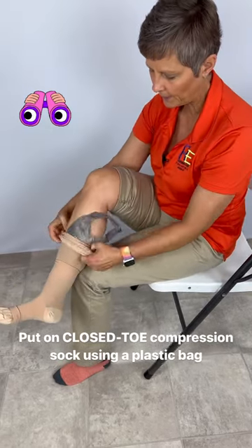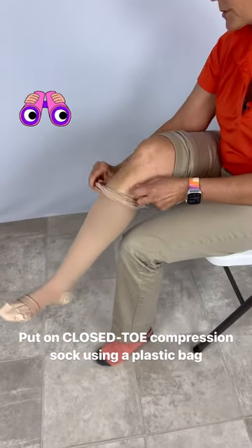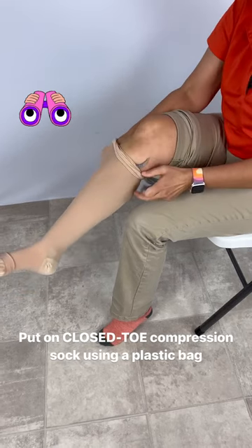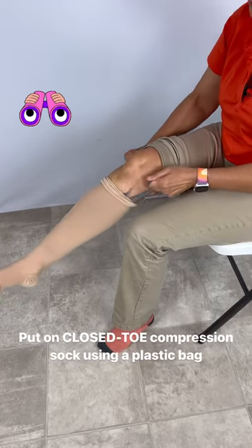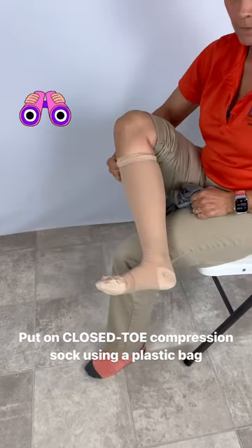Go ahead and pull the stocking up, just like that, and then I'm going to grab a hold of the handles here and very easily — whoops — just try to pull it a little bit. Sometimes this happens with the handles, but I'm going to try to pull it a little bit like this, right out of the stocking.